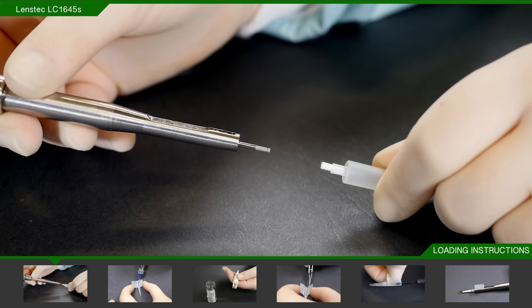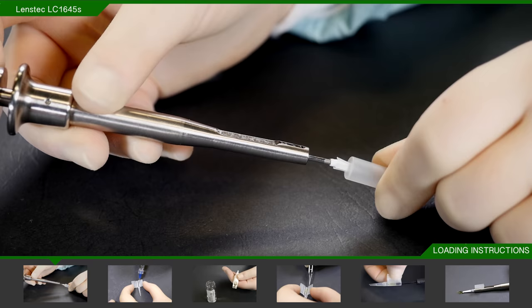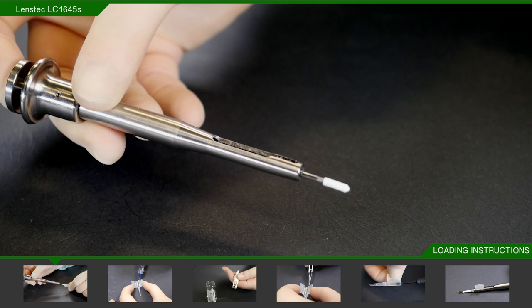Firstly, place the plunger tip onto the injector plunger. There is a small rebate in the end of the plunger which will hold the tip in place, and you will feel a slight click into place when attaching it.